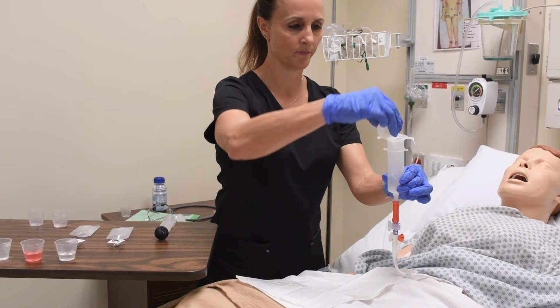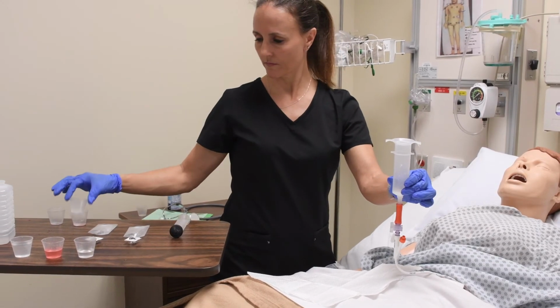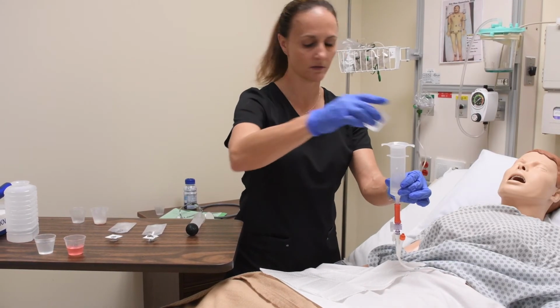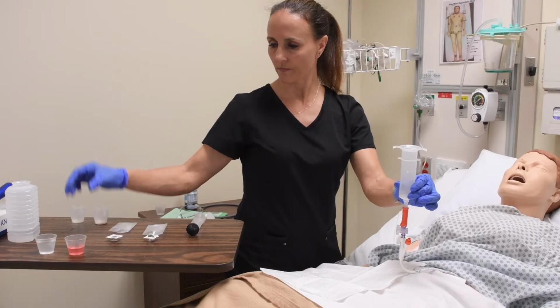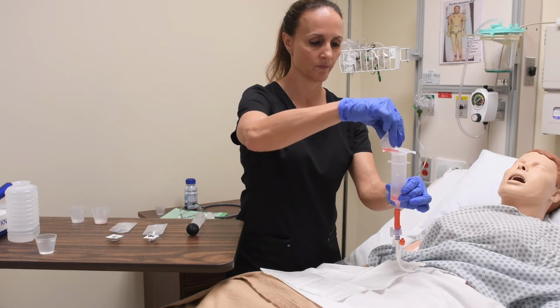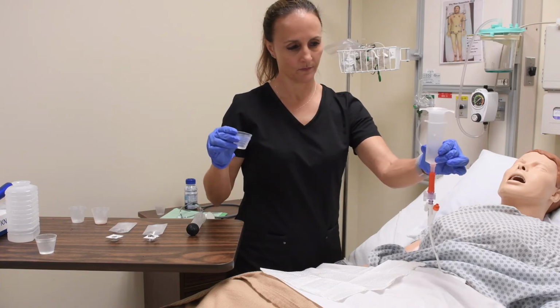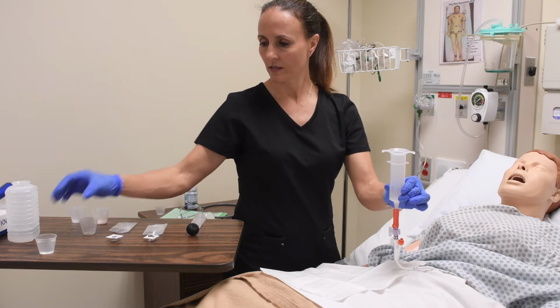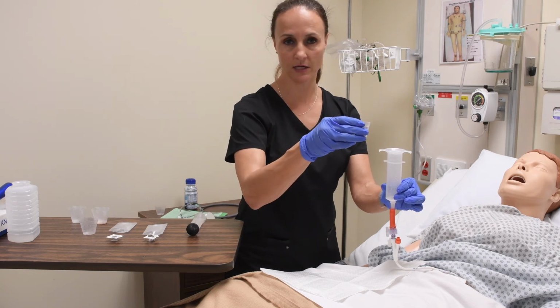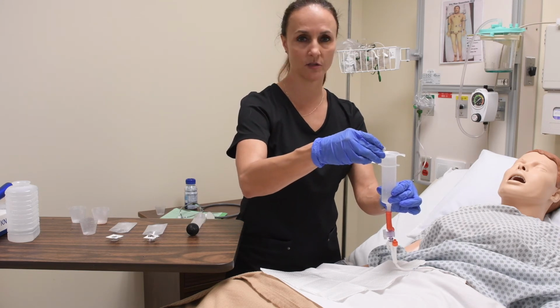Medication. Flush. You doing okay, Mrs. Jones? And then I have one more medication. Now I'm going to flush with 30 mLs because now I'm done with my medications. And this keeps the tube patent.